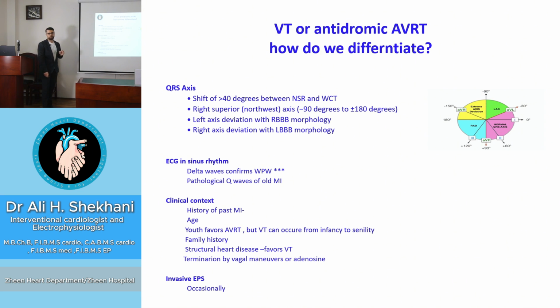Without history, even more experienced cardiologists sometimes will wrongly interpret the ECG. And definite diagnosis, of course, is by EP study. Sometimes some ECGs may be very difficult, and you cannot be 100% sure about VT or SVT. But as I told you, whenever you are in doubt, you have to manage as VT.